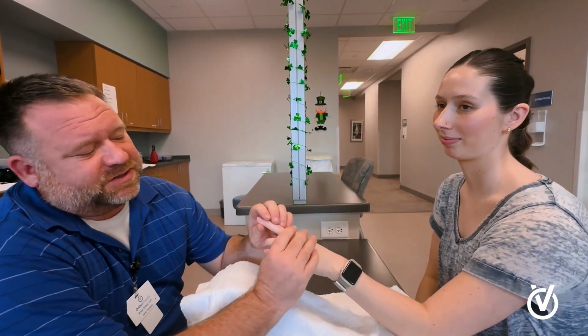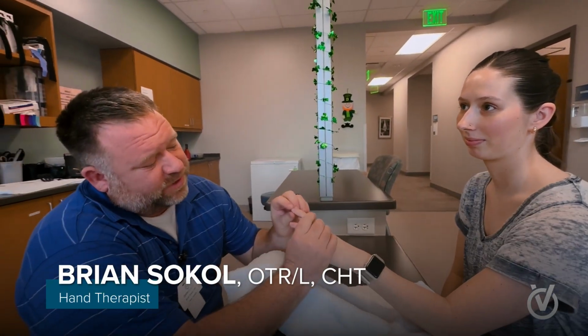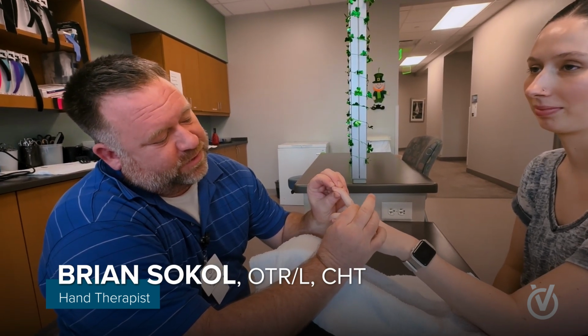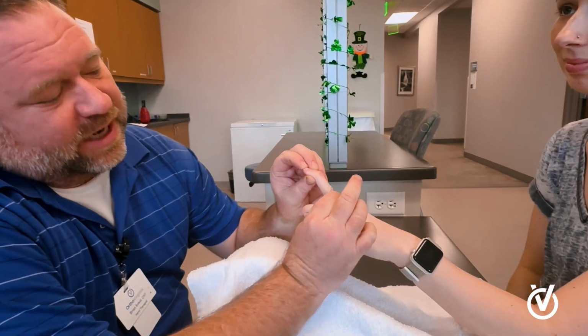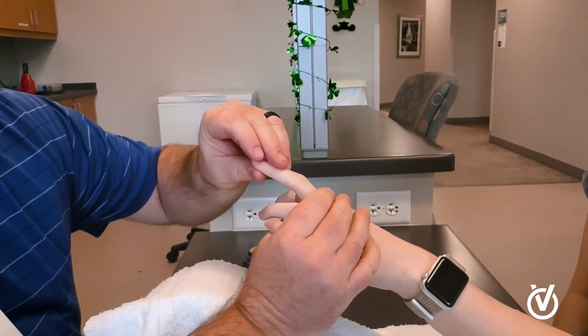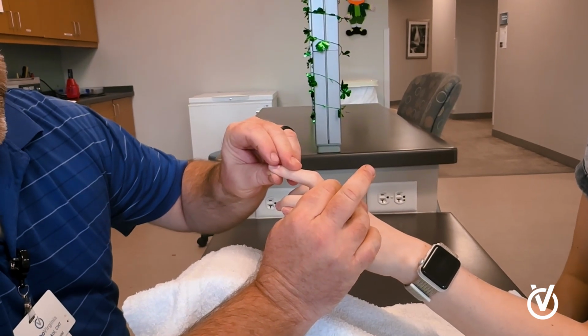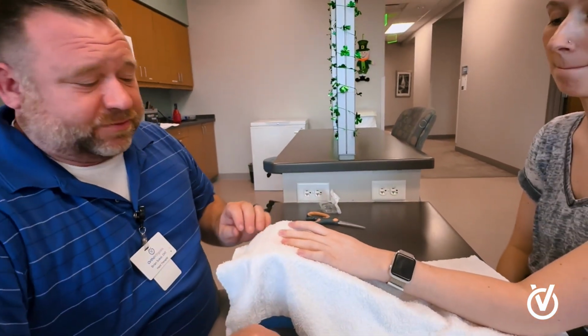One of the hardest things to deal with in hand therapy is whenever you have a mallet injury in addition to a swan neck deformity, which looks like that. We have to make a brace that straightens the DIP joint and puts this in a little bit of flexion, which can be very hard to do. But I've got a trick that works for me.